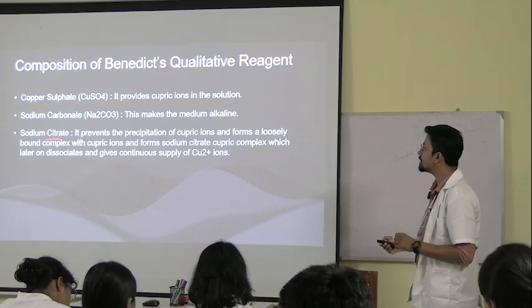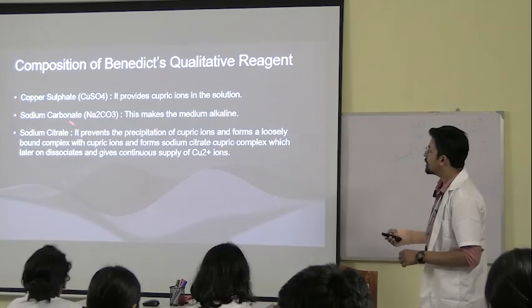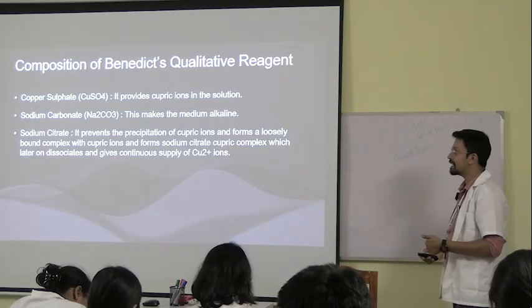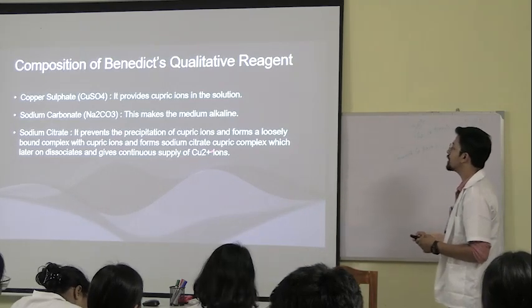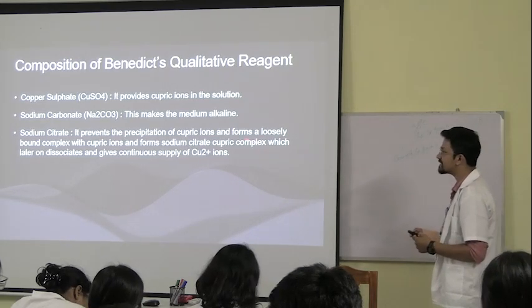So that is the importance of the sodium citrate. It prevents the precipitation of the cupric ions immediately and forms a loosely bound complex with the cupric ions, forming the sodium citrate cupric complex. This is the complex that it forms.